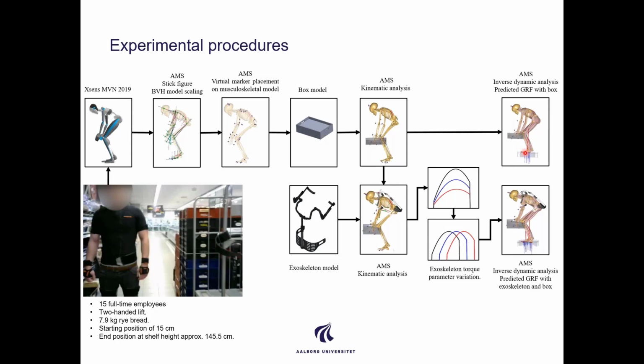And then we actually performed the analysis, of course. We also predicted the reaction forces for the interaction between the hand and the box by implementing these contact elements here as well. And then we had that analysis. That was just one of the simulations we did for the 15 subjects for all the 4 tasks, or the 4 repetitions that they performed.